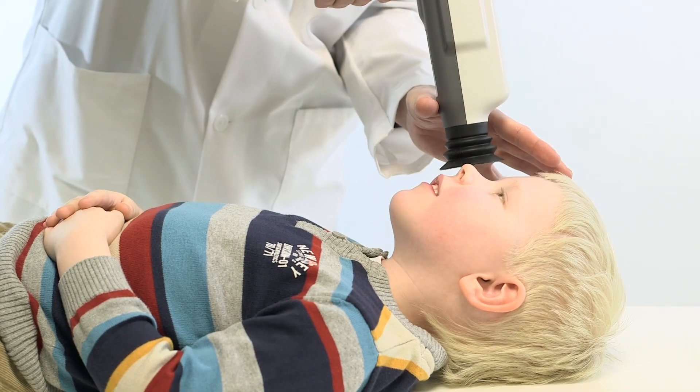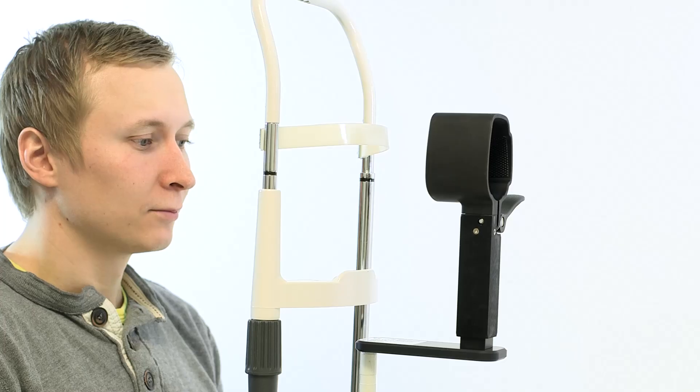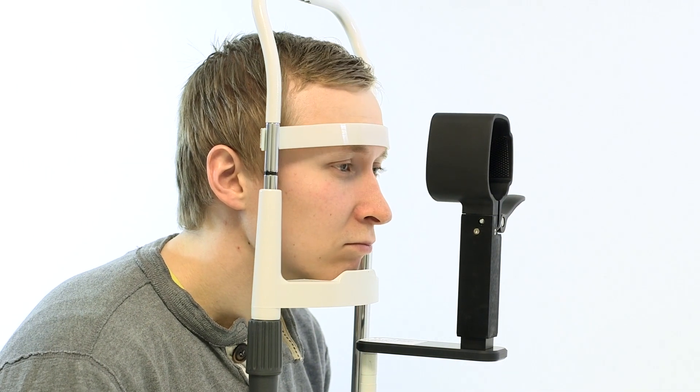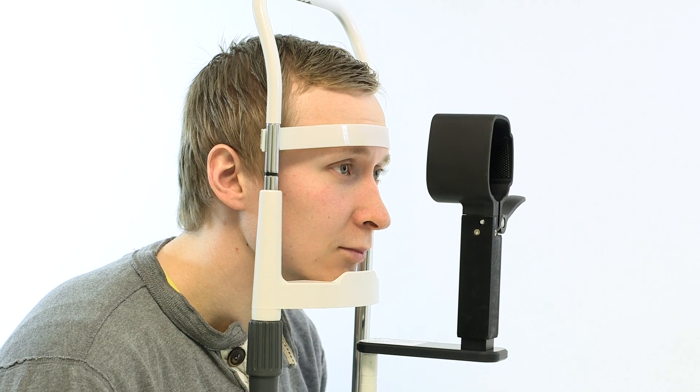It is also possible to use the camera for patients lying down. Inform the patient about the procedure. Confirm that the patient is well positioned into the patient headrest for imaging and confirm that the patient's pupils are dilated. The patient is asked to stay still and look at an internal fixation target.